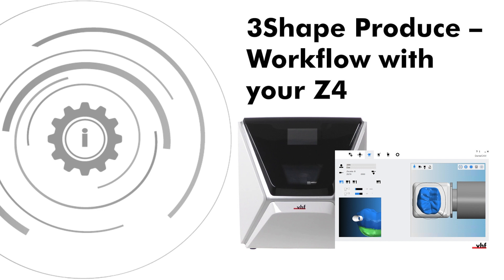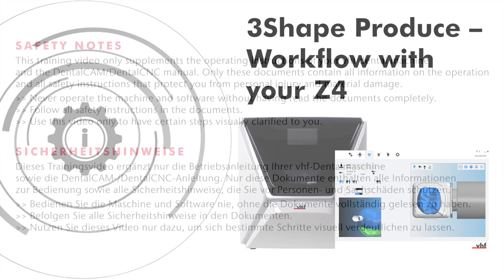As part of the 3-Shape Produce Workflow, you will work with TRIO's Design Studio as well as the VHF software DENTAL CAM.